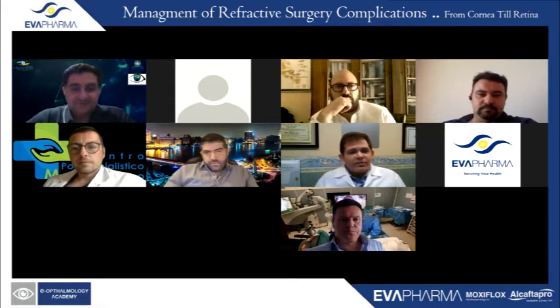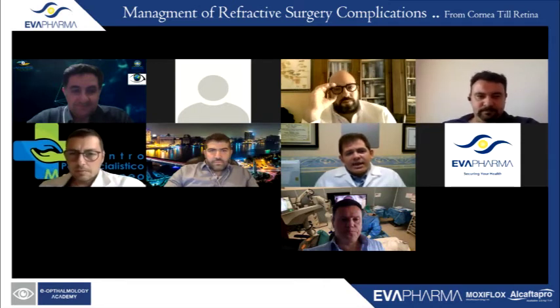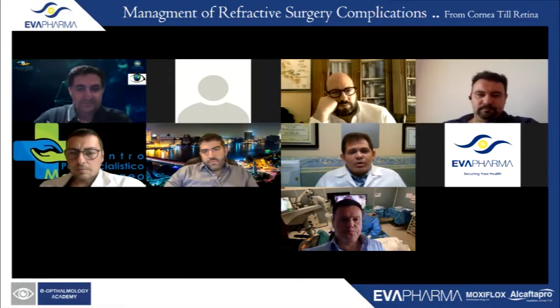So we are evolving. Eventually, in 5 years, 10 years, people would say, oh, we were doing LASIK without tomography. Maybe they will come to say that tomography was never needed. But I would say that having the data is important for understanding ectasia susceptibility. We never know everything, but we know more than what we knew a few years back.